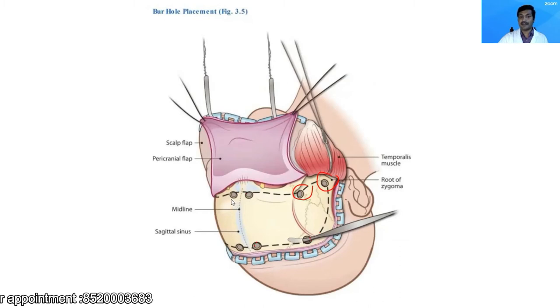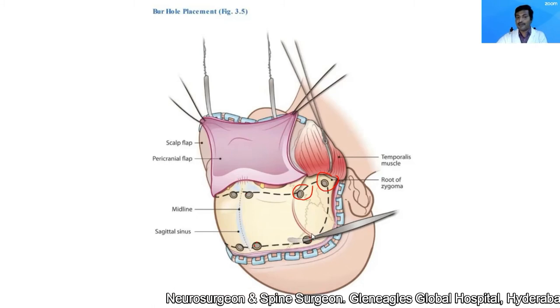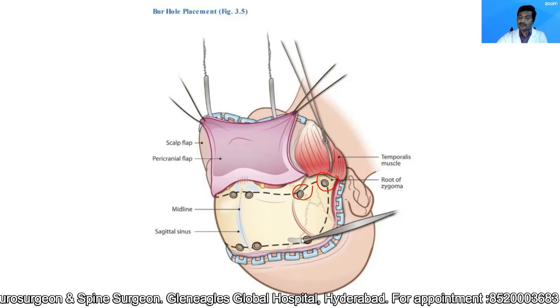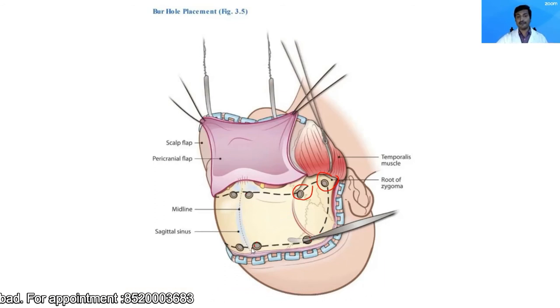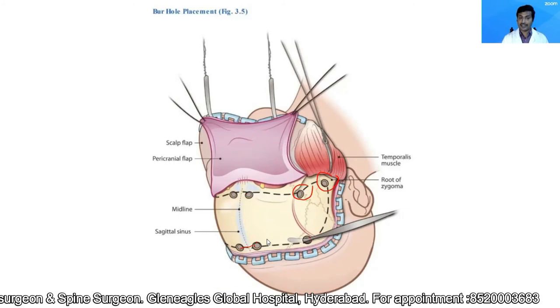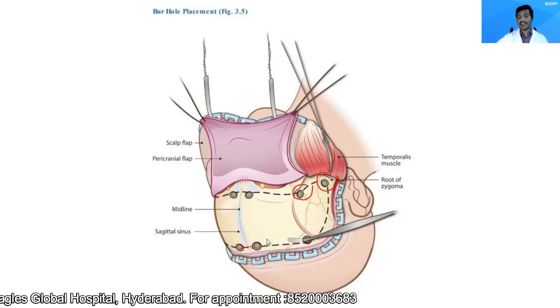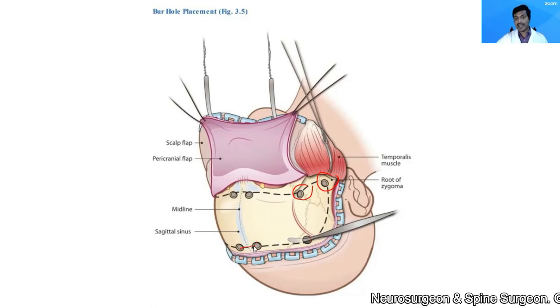Using a Penfield dissector, separate the dura mater at the level of the burr holes and also beyond them as far as possible. When separating the dura between the two paramedian burr holes, be very careful — if the dissector enters the superior sagittal sinus, it can cause catastrophic bleeding.